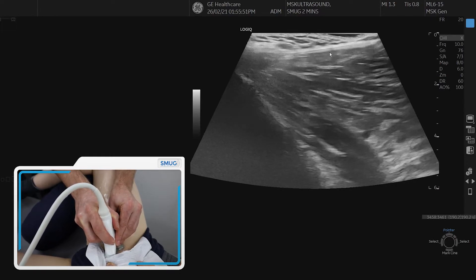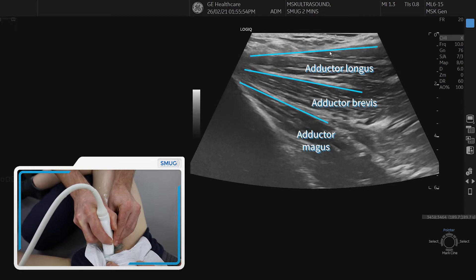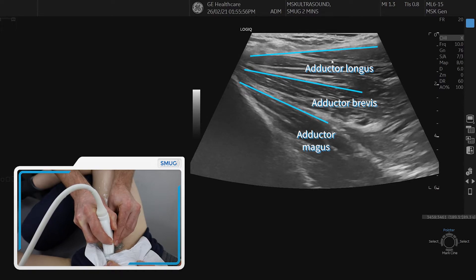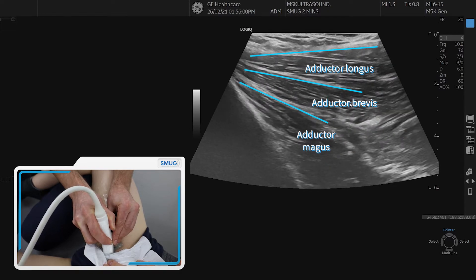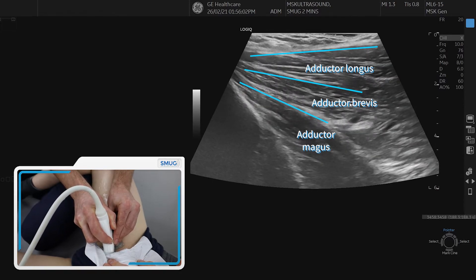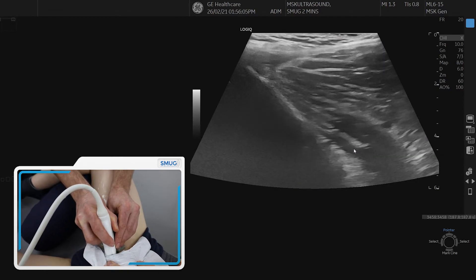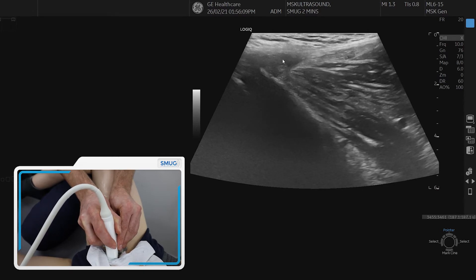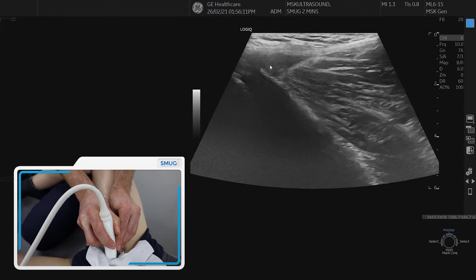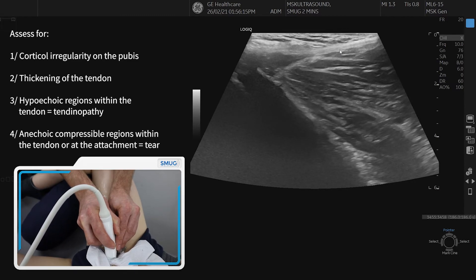Just slightly more distally, just to orientate yourself, you can see the three layers: adductor longus at the top, brevis in the middle, and magnus at the inferior aspect of the picture. It's very important to look carefully for any cortical irregularity of the pubic bone and for any tears or hypoechoic regions in the common adductor tendon.